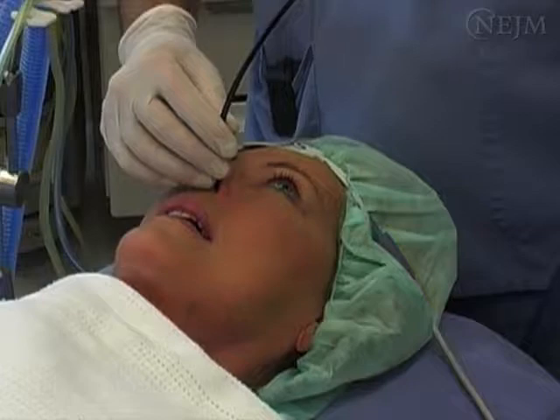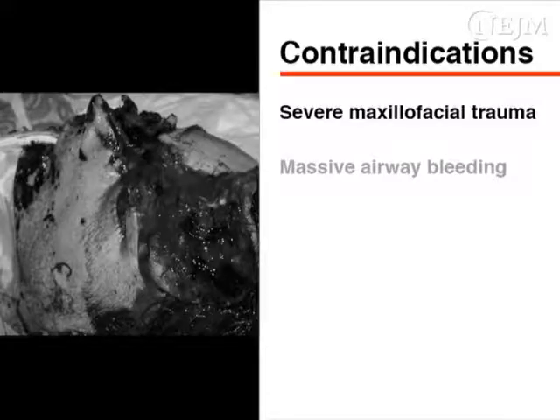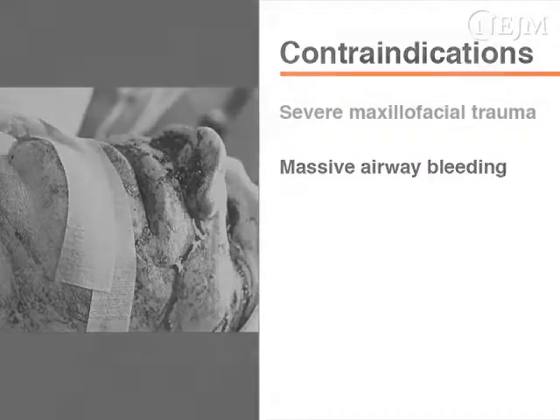Nasal fiberoptic intubation should be avoided in patients with severe maxillofacial trauma, since the fiberscope or the tube may inadvertently enter the brain. Massive airway bleeding is a relative contraindication to fiberoptic intubation and should only be attempted by experienced anesthesiologists.